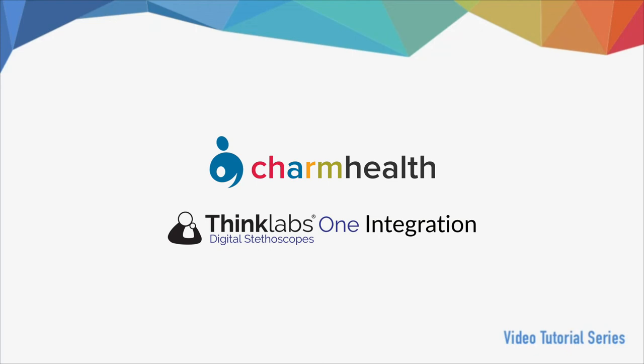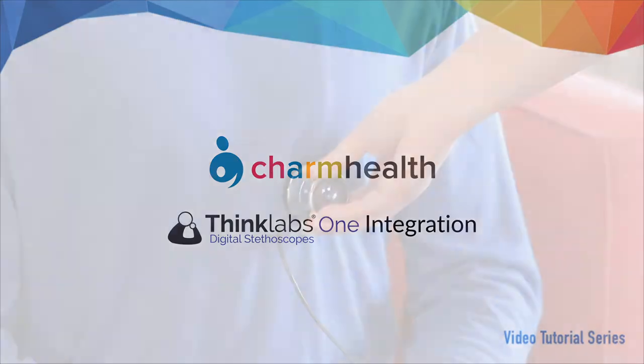Welcome to Charm Health, your medical records management and practice management application on the cloud. In this video, we will go over how to set up the One Digital Stethoscope and use it during telehealth visits.